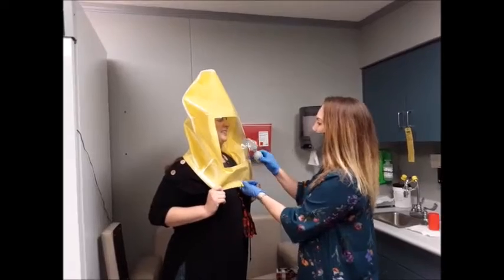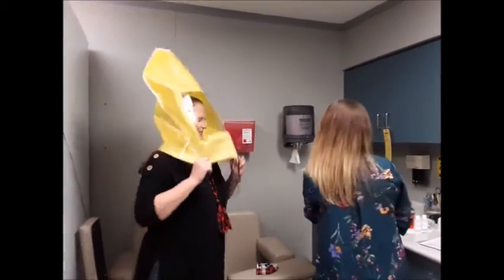Do you smell it? Okay. Go ahead and take the tent off. Sweet.